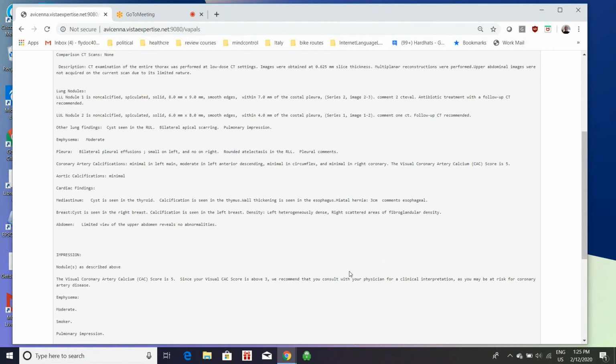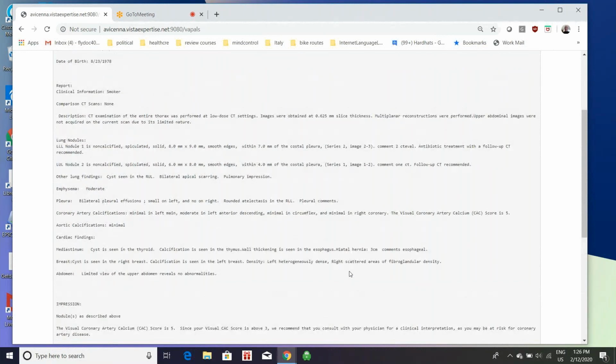when trying to use that in the VA, because the purpose of doing this report is to help the radiologist write the report about the evaluation of the scan, and so this is meant to be an input to their report. They use PowerScribe, which is a very fancy radiology report editing system, and they have report templates inside PowerScribe. So what was really needed is that we generate the content as raw text, so it could be easily copied and put into the PowerScribe system, and then run through the PowerScribe template into the report.